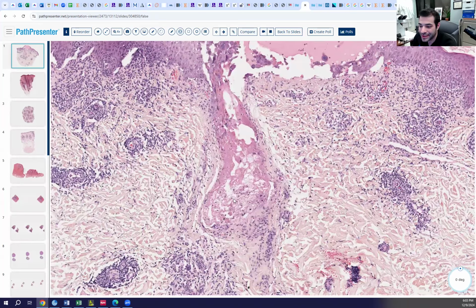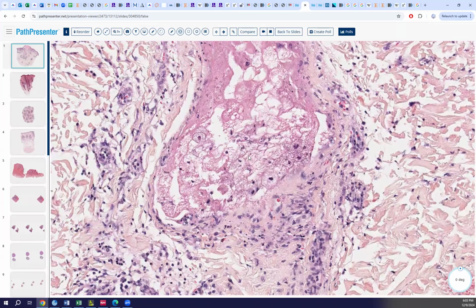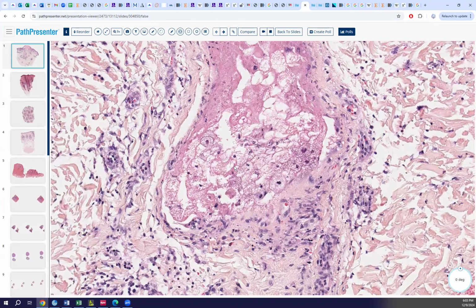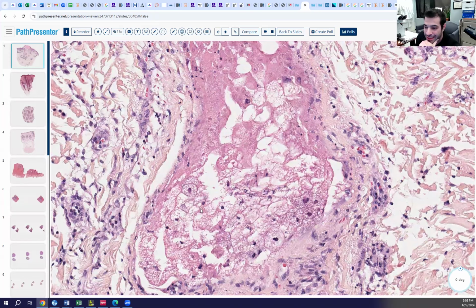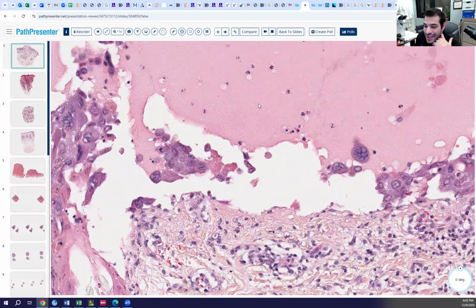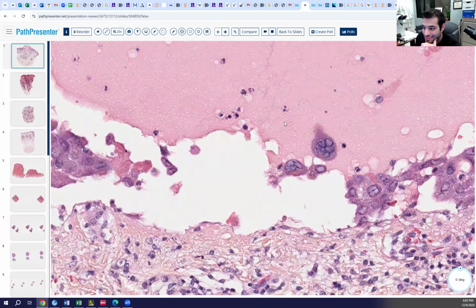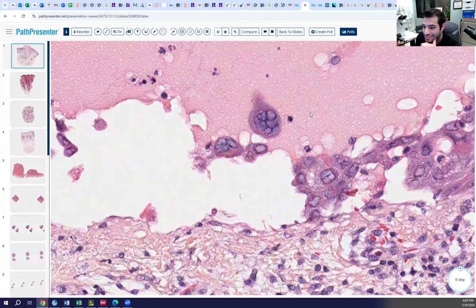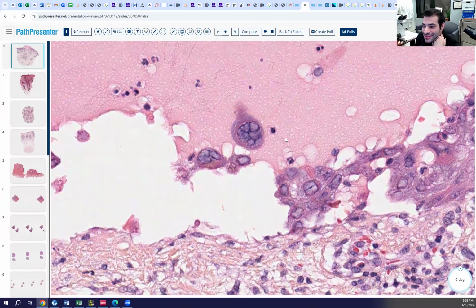What do you think about this sebaceous gland? Oh yeah, the sebaceous gland itself also looks not great. There's a bunch of neutrophils there as well. Yeah, it's kind of dying. Any other type of cell in this vesicle that looks interesting? It looks like it is multinucleate. Yeah. What else about it?